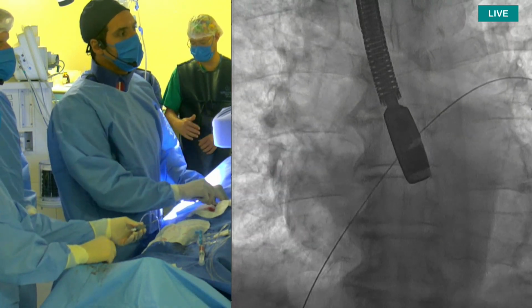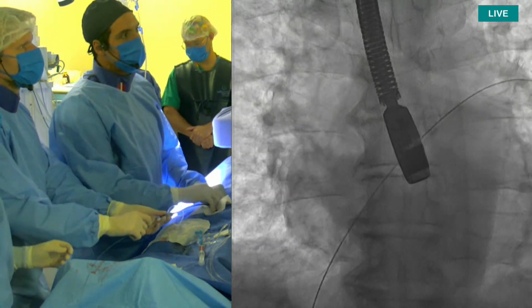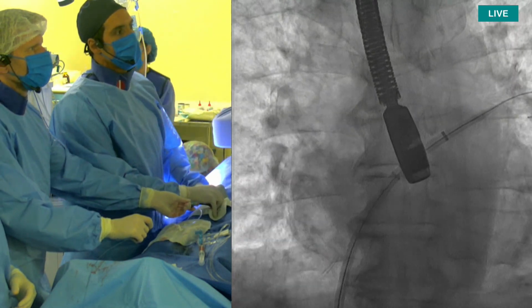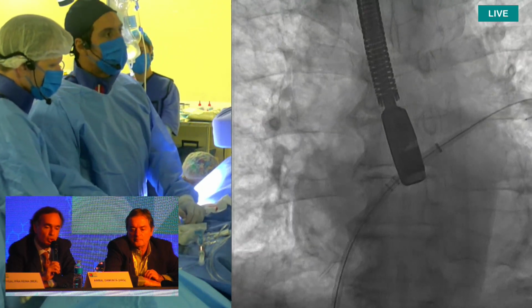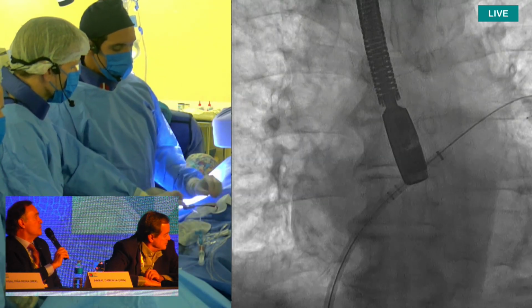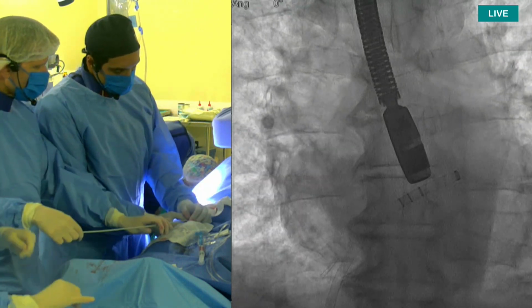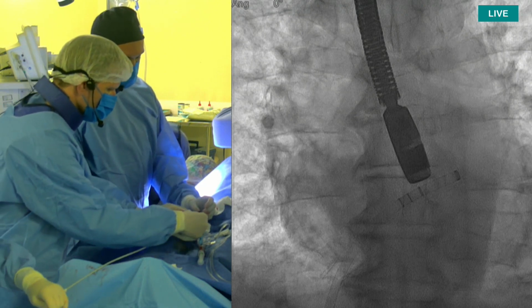I thank you for the question. I will start. I still do half dose before the puncture and half dose after the puncture, but I understand that when you guide the transseptal puncture this way, you can do all the heparin before the transseptal puncture without any safety concern. I don't know, Enio, if you agree or if you do it differently. I do the same way. I think that the transseptal puncture under echo is totally safe. And then I do half, just as you do.